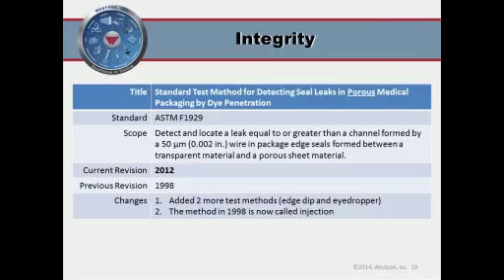Herb, do you have any input? You're right on, Katie. It tends to be shown over and over again that the distribution testing will produce a more vigorous result, a conservative result, if you will, if the sequence of events is conditioning first and then transit testing. So that's generally why it's included in the sequence that it is, namely prior to the actual distribution testing, produces a more conservative result.